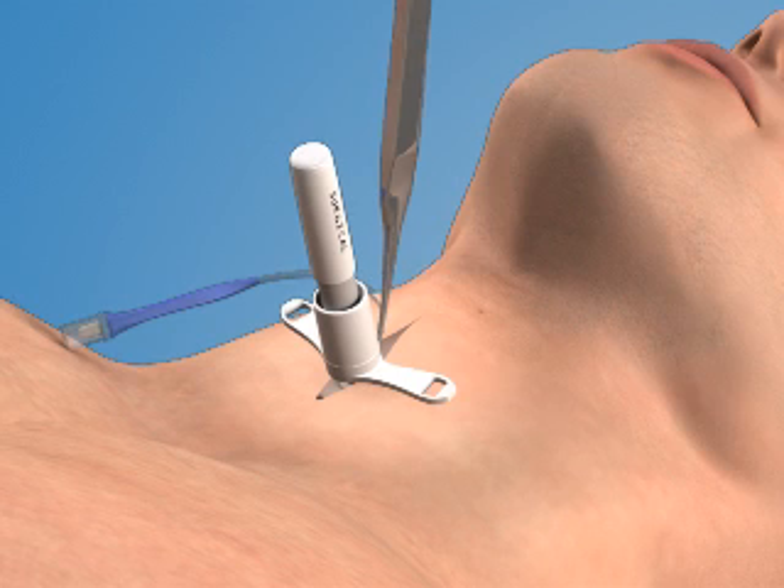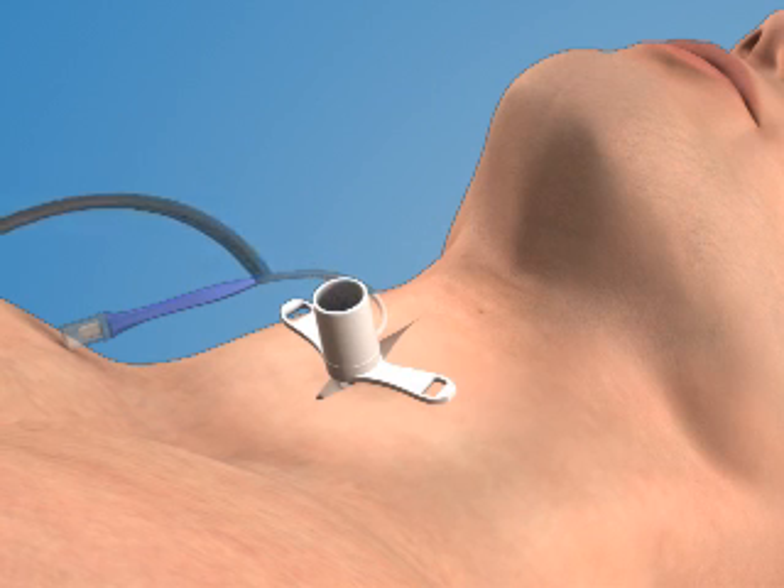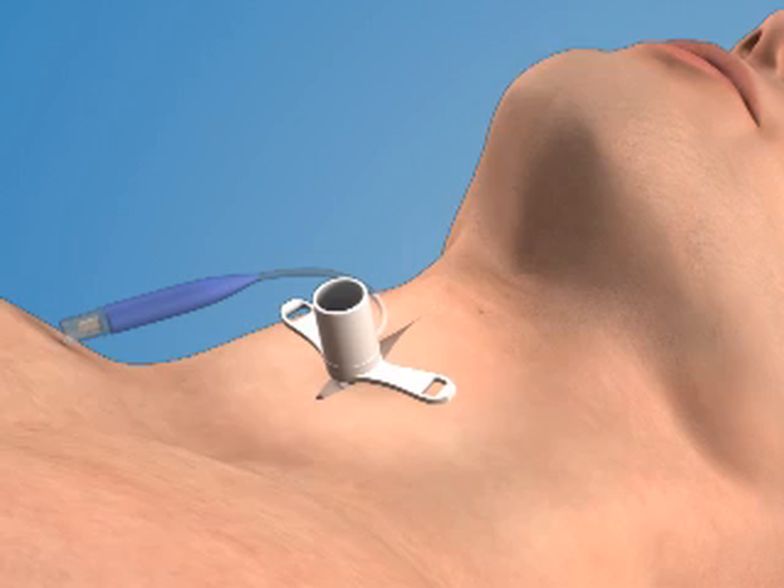Once the tube has been fully inserted, you can remove the tracheal hook and the obturator from the airway catheter. Finally, inflate the cuff with air and begin to ventilate the patient with a bag valve mask.